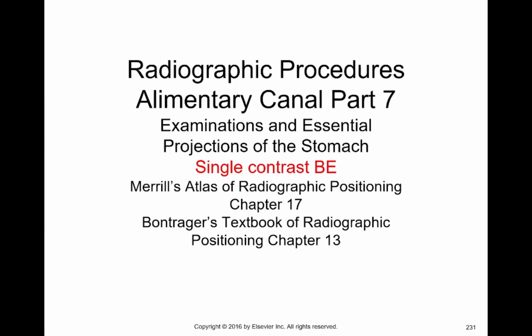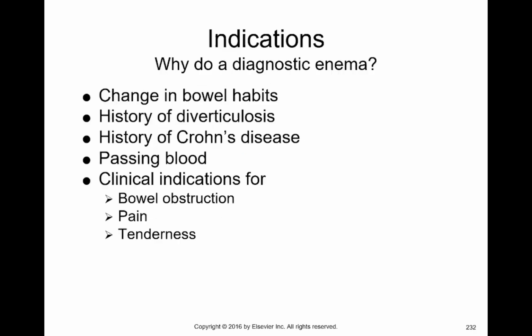In my personal and professional experience, the difference between single contrast and double contrast is that the double contrast includes all of the projections of a single contrast but has more in addition. So I'm going to cover all the positions for single contrast, close that recording, and do another one for double contrast, not including the projections for single contrast, just to keep the video short. But I am going to include the pathologies on the double contrast on the second recording.